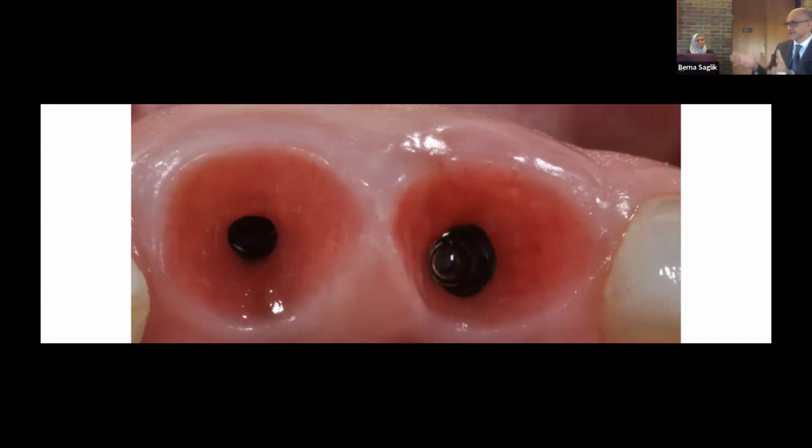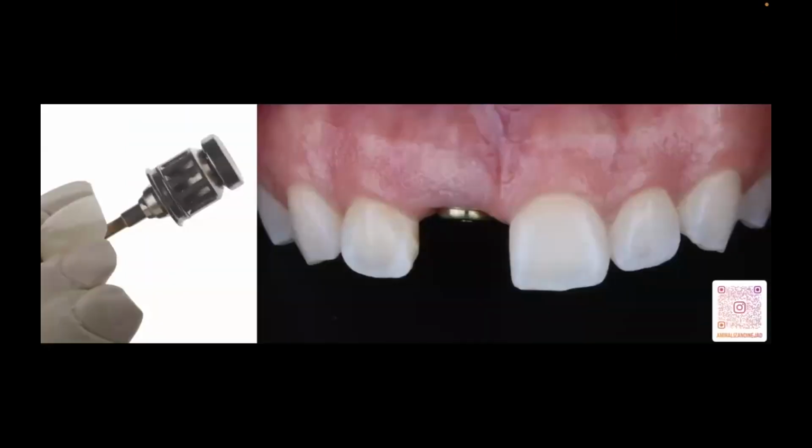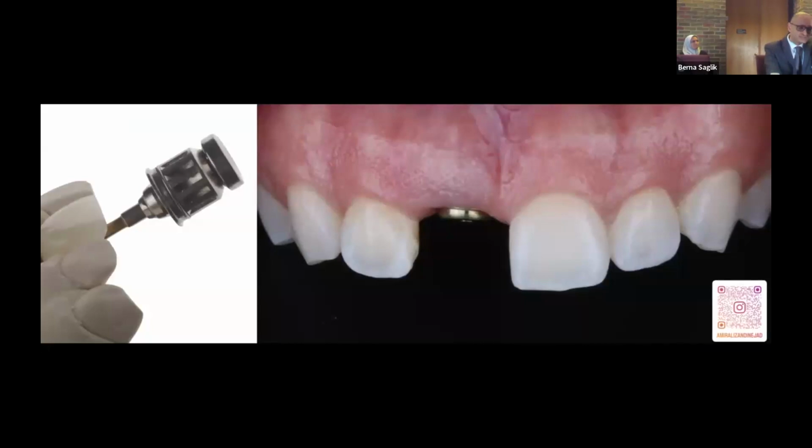I'm not saying that randomly. Studies need to come out to tell you exactly what that roughness is, which we have started. But that gives you a good connective tissue attachment. And not only that, if you have a strong attachment, it can support your epithelial attachment. So maybe you get a better papilla, or maybe those rules about 4 millimeters from the contact point to the bone for papilla filling may change, because now we have good connective tissue to support it. Let's see how it changes.